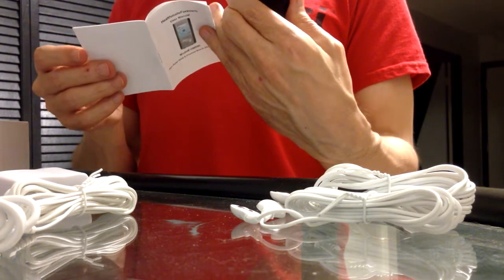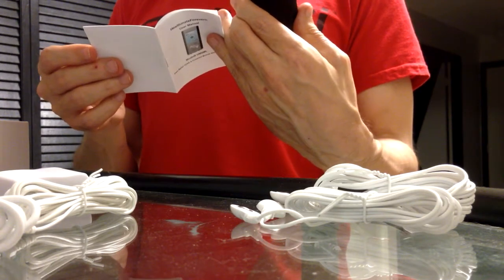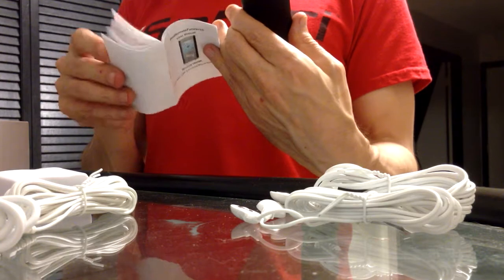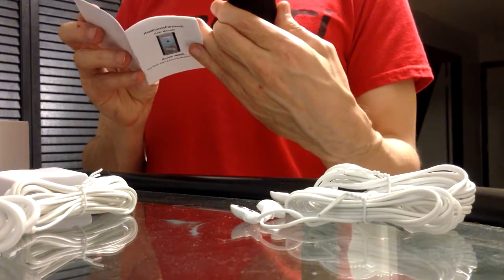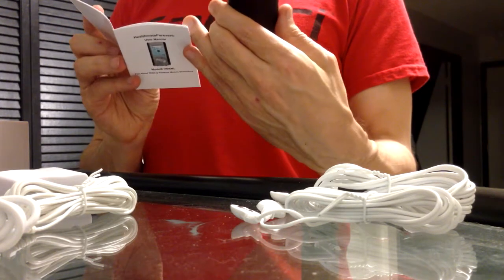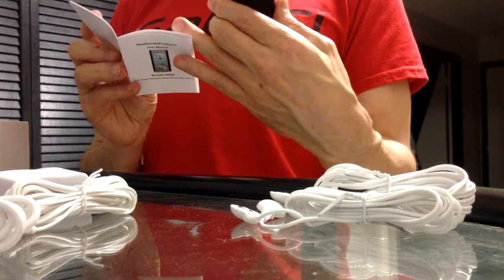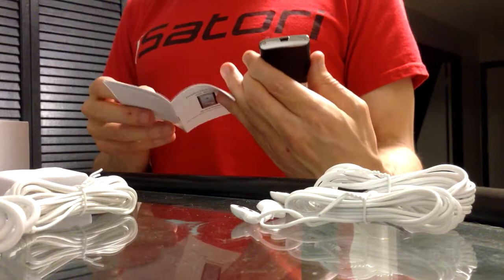How to use the device: before using the device please check the following information — check the pads for any damage, check the electrode wires for damage. Well, it's brand new so I hope there's no damage. Remove the plastic films on the pads, place pads on your body — place pads on the area where you'd like to treat. And then they show you some figure of some sort.